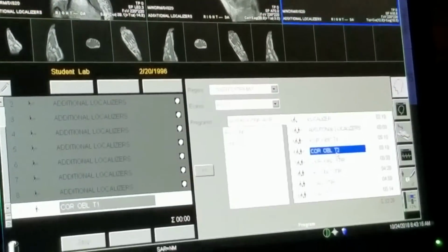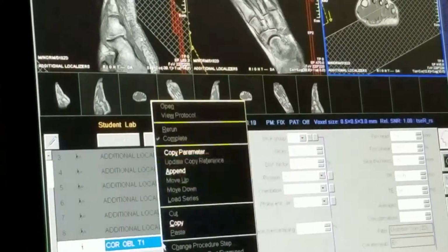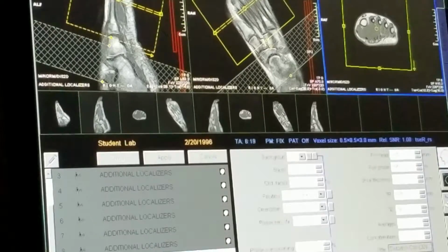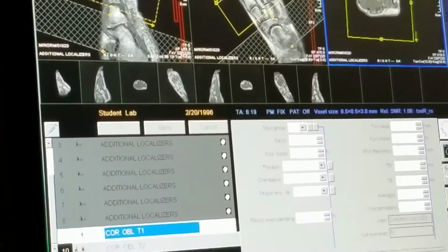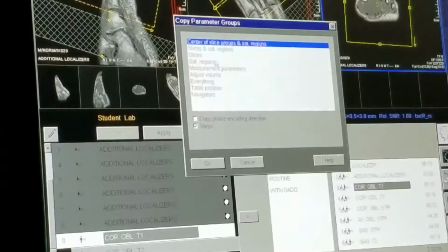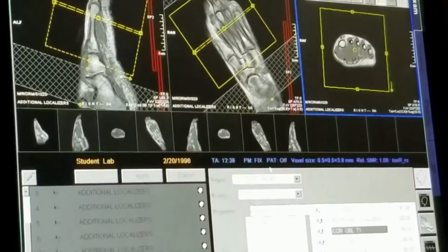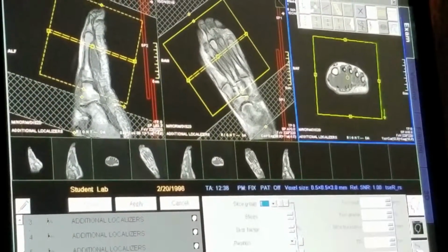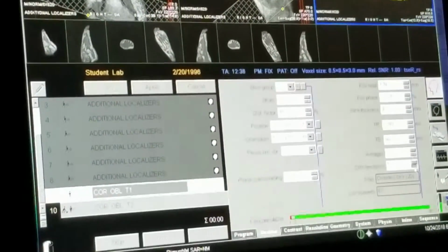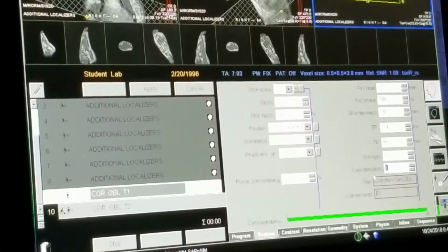The next thing our site does is a coronal oblique T2, or once again a short axis T2. So I'm going to copy. We can actually copy slices for this. It'll change the number of slices. So it changed it, but it also concatenated it. We can concatenate if we want, or we can just go down to one concatenation. We'll just do one concatenation.